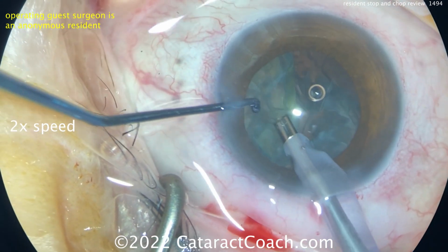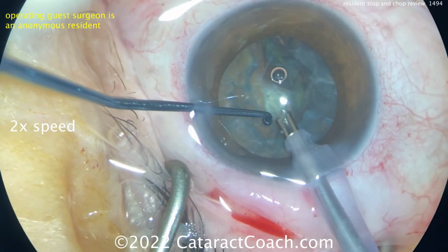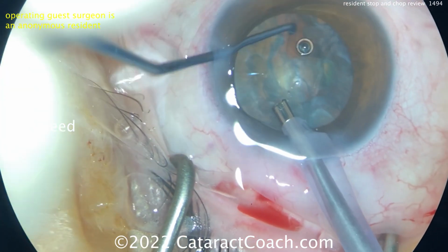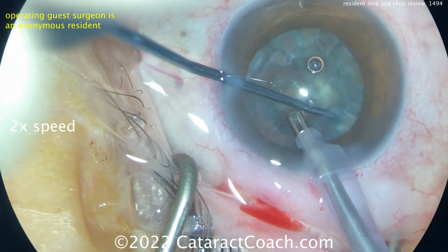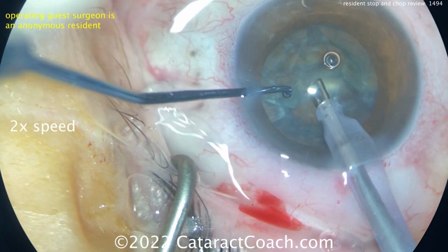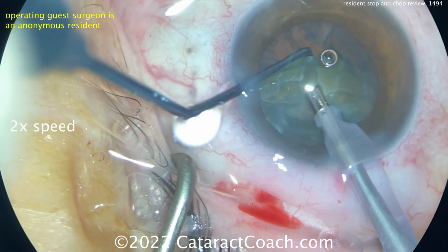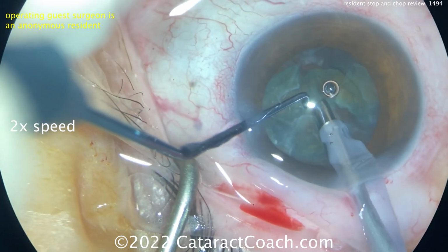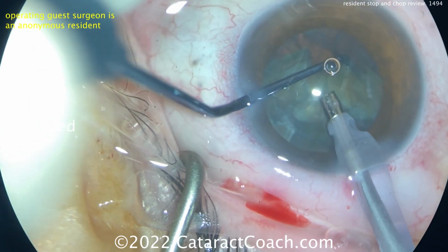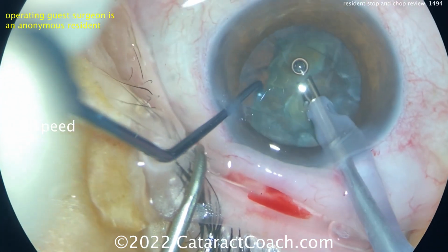With more practice, this is a case where I'd like to slightly prolapse out of the capsular bag, what I'd call a flip and chop or tilt and chop. Get it a little bit out of the capsular bag first, and then I can get the chopper and split the nucleus up into smaller pieces. So here's the remaining hemi-nuclear piece, chopper going behind it here. You can try a little chop if you want to, but more importantly, just to hold the piece so you can occlude the tip of the phaco probe with that material and aspirate it.